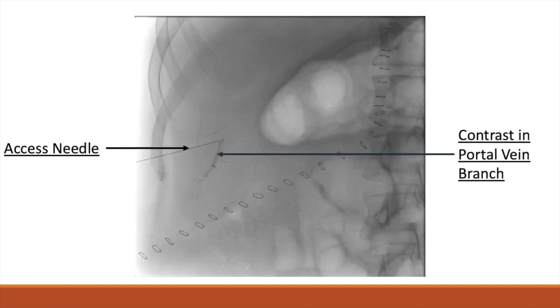Next, the stylet is removed from the access needle and contrast is injected into the needle under fluoroscopy to confirm access into an acceptable portal vein branch. We see contrast leaving the access needle and entering the portal vein branch accessed in the previous step, confirming the positioning of our access needle.